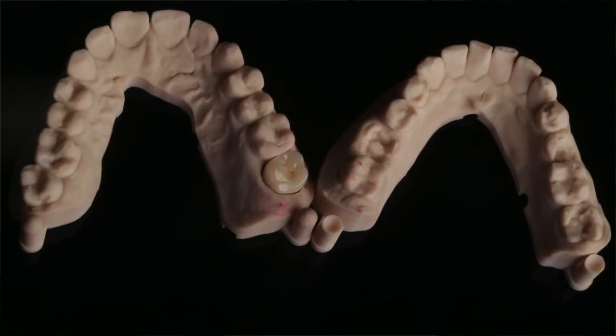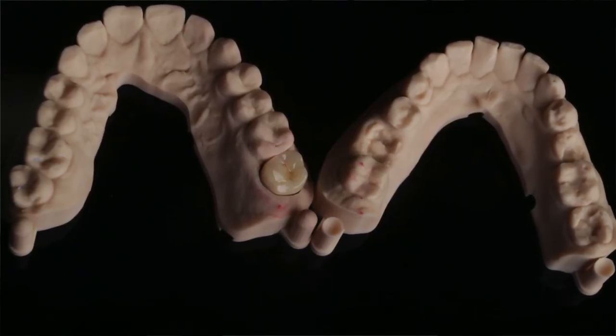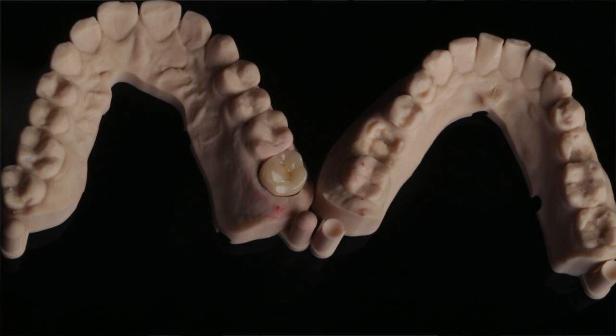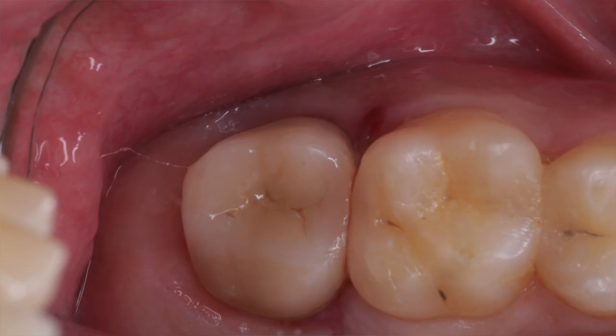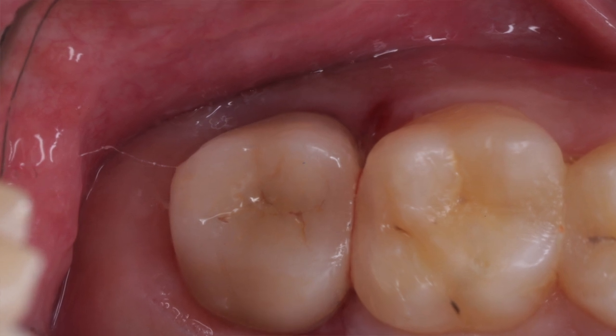The final crown is then sent to the dental clinic, where arrangements are made to fit the final crown into the patient's mouth. This is what it looks like when the final crown is fitted. The bite is checked again. Modifications can be made to this, and once this is fitted, the patient can go back to eating everything that they could with their natural tooth.